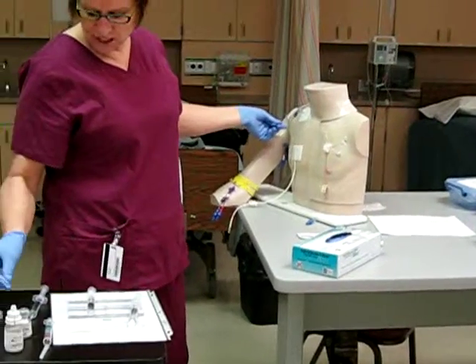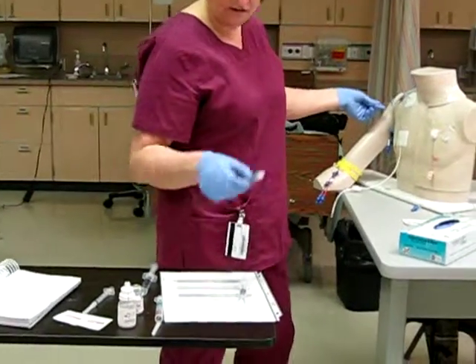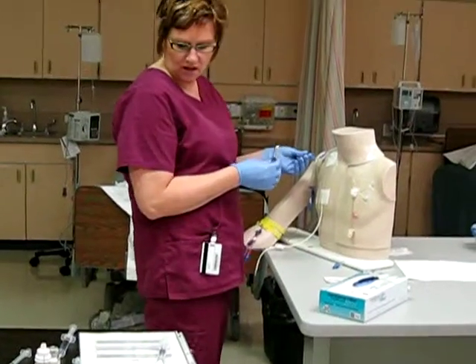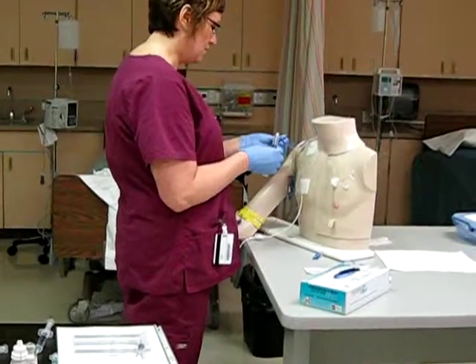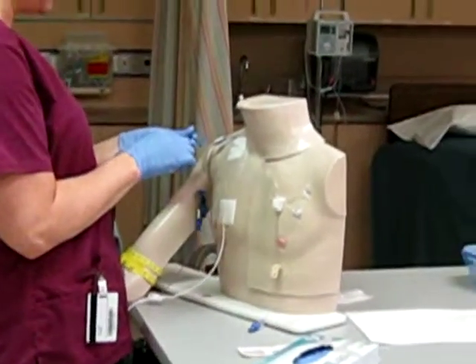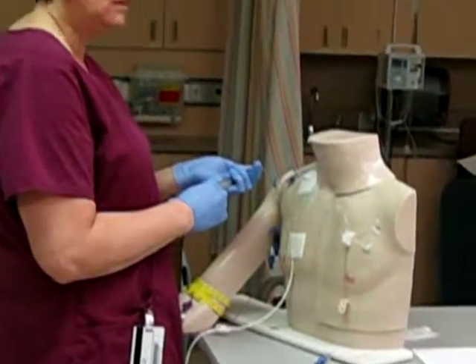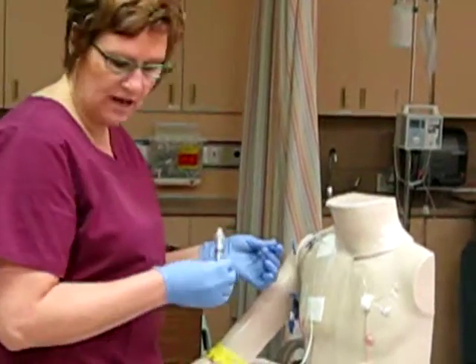And then I'm going to give the 5 milliliters of NS and Dilaudid. And so the port has not been touched, so I'm going to go ahead and insert that at 2 to 3 minutes. I'm going to screw that.